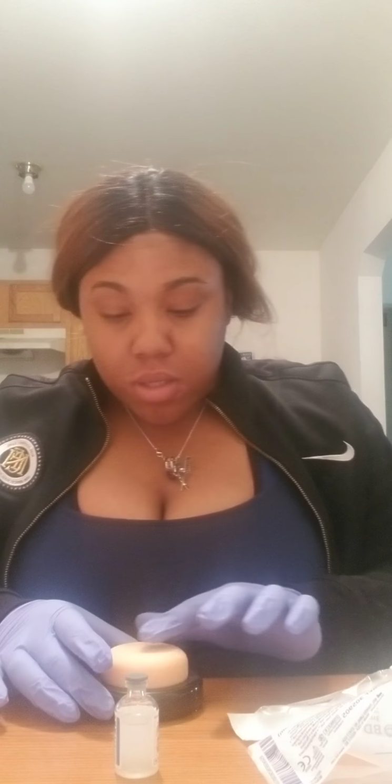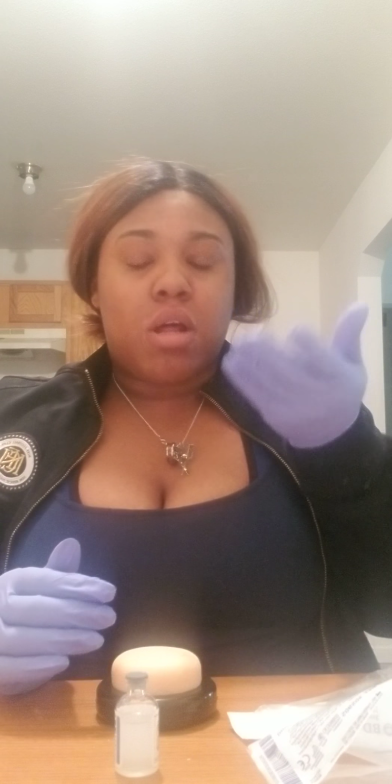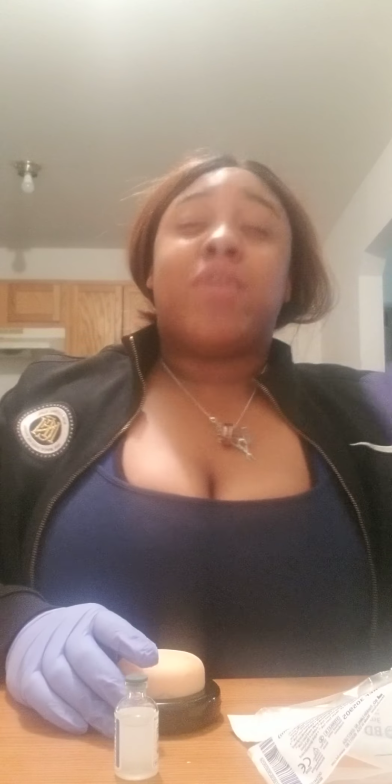Now, as you can see, I have a wheal. If you have that, that means you're doing a good job. That means you did it. It was successful. Now, if you don't have a wheal, which is just a slight elevation, you just redo it.